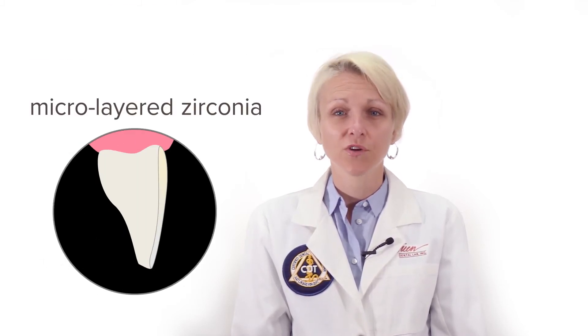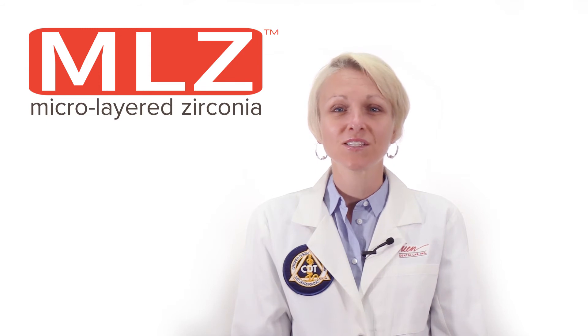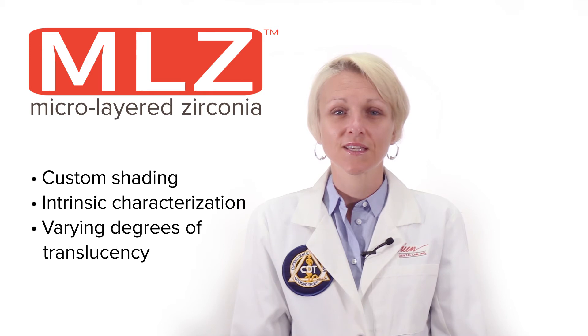A solution that gives us the strength of the zirconia and the aesthetics of the veneering ceramic is to selectively layer the ceramic. We call this technique micro-layered zirconia, or MLZ for short. Layering ceramic allows us to meet expectations of custom shading, intrinsic characterization, and varying degrees of translucency.